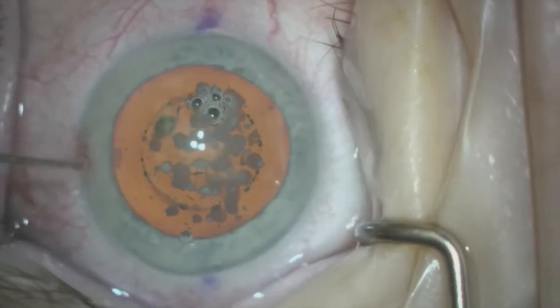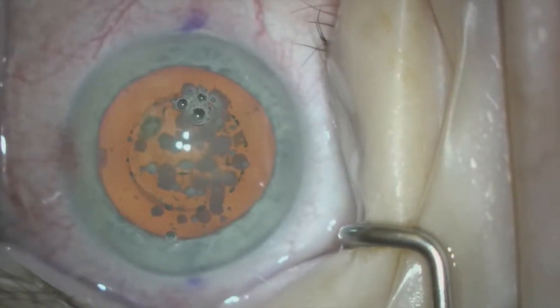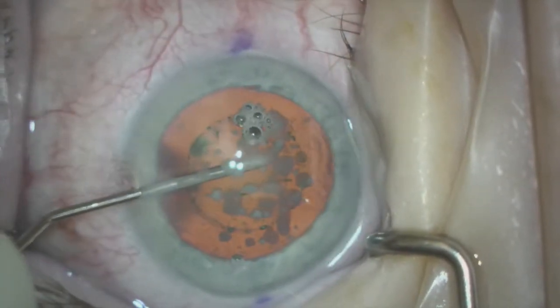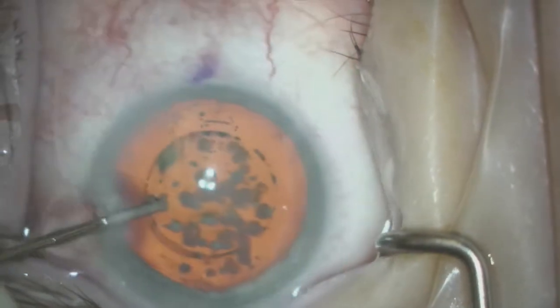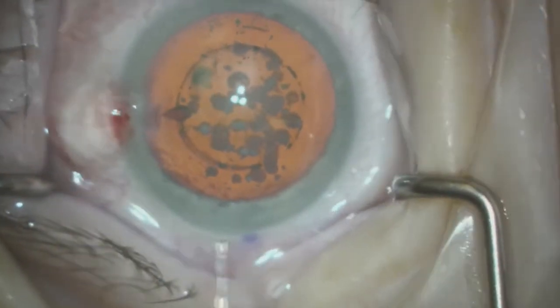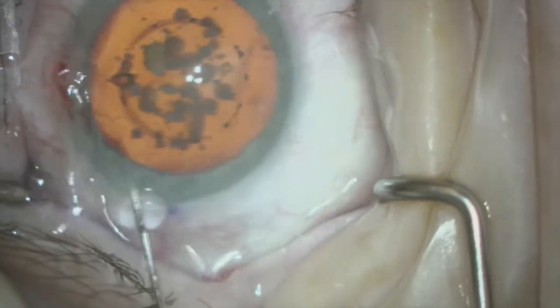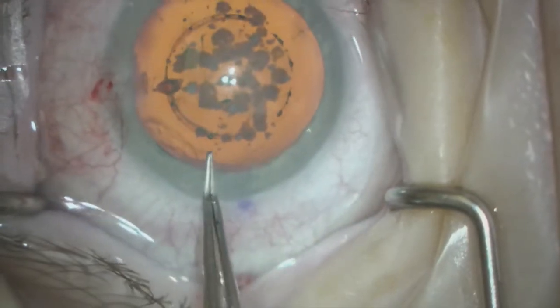This image is from the initial part of the cataract removal. We open our femtosecond laser incisions, insert Healon viscoelastic to protect the corneal endothelium, and tamp it out of the lens. We open the primary incision and then place a bent needle cystitome on the Healon.